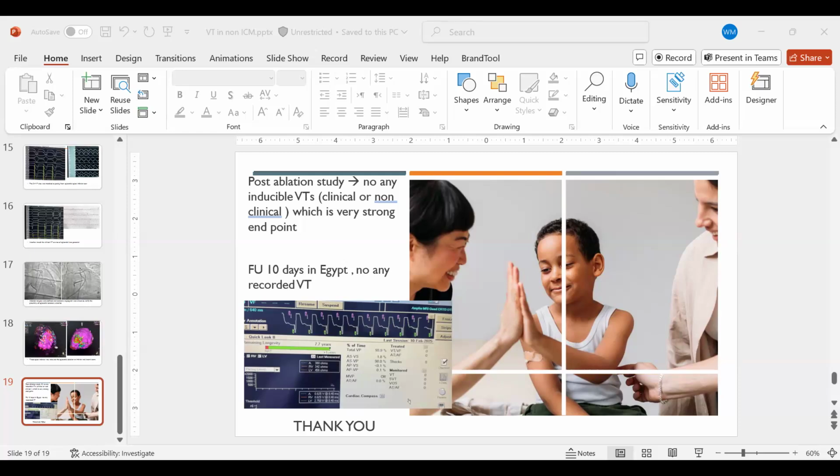I want to remind you, John, that you started with the epicardial access first. Yes, we knew that we would need epicardial. In such a patient, we already did the epicardial access: just put a wire in the epicardium, even without a sheath, just put the long wire, and then do the endocardium and give heparin.